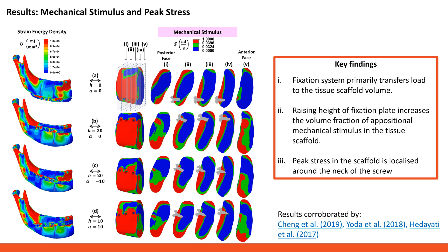Our second key finding is that raising the height of the fixation plate increases the volume fraction of appositional mechanical stimulus in the tissue scaffold. And thirdly, our peak stress findings show that all peak stress locations in all 19 models occurred in the region of the hole where the neck of the screw is in contact with the scaffold. The maximum peak stress value measured was 2.5 MPa, which is much weaker by a factor of 40 than the ultimate material strength of the bioceramic material.